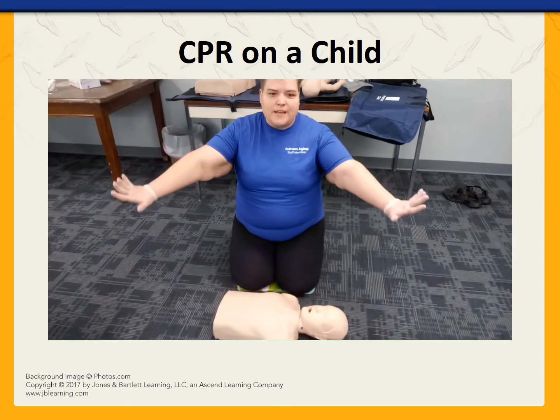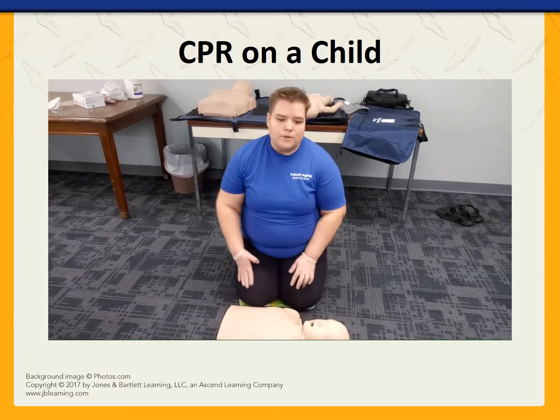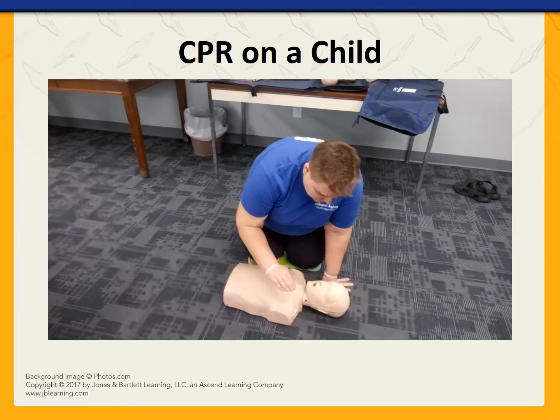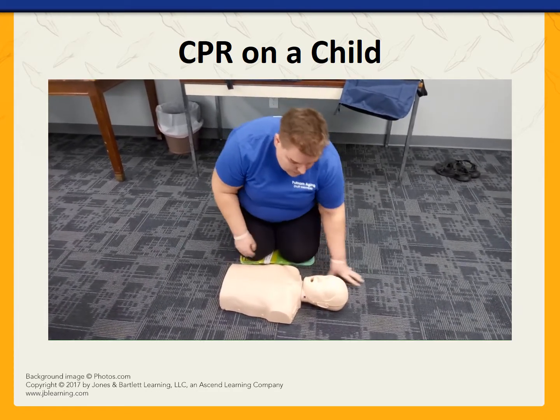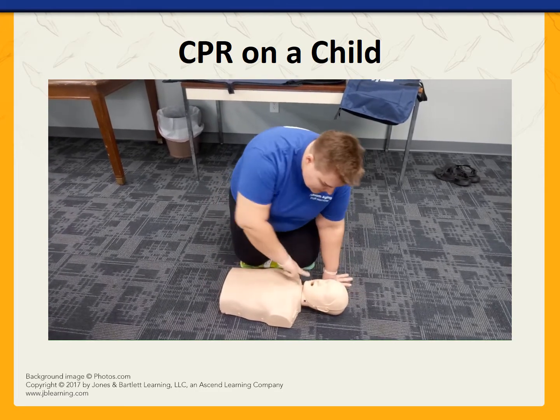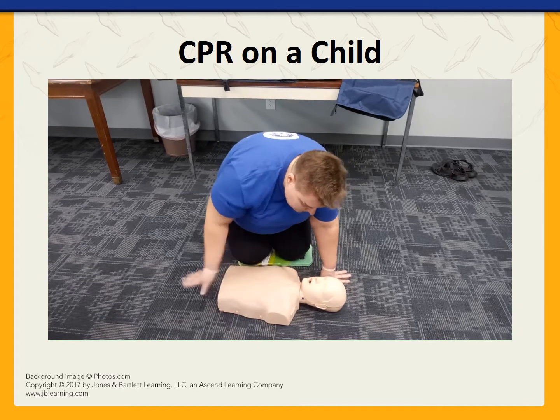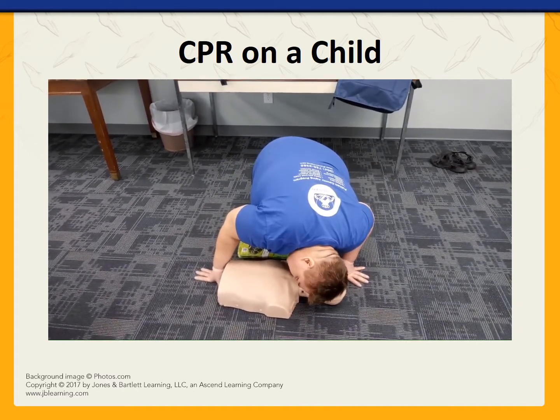Check the scene for safety. It is safe to assist this person. First, we're going to check to see if they're responsive. So we're going to do a firm tap to the shoulder. Child, can you hear me? Child doesn't respond. I'm going to check for a pulse on their carotid artery. I don't feel a pulse. I'm going to lean over and check for breathing to see if their chest is rising and falling.